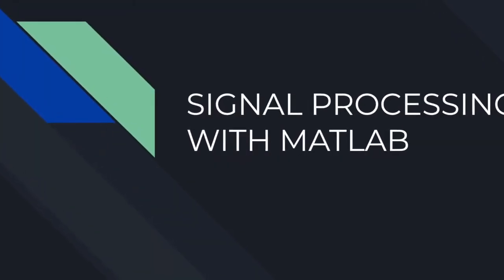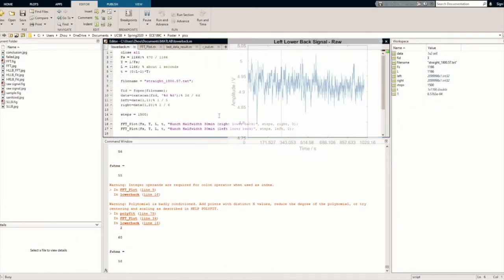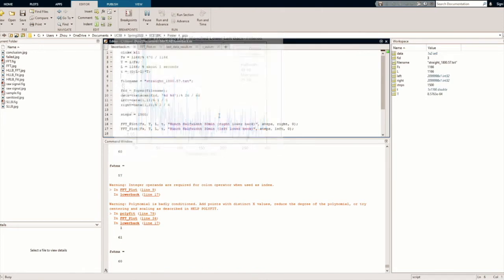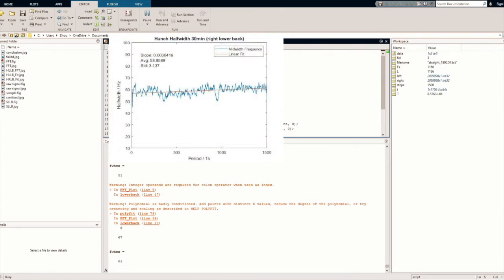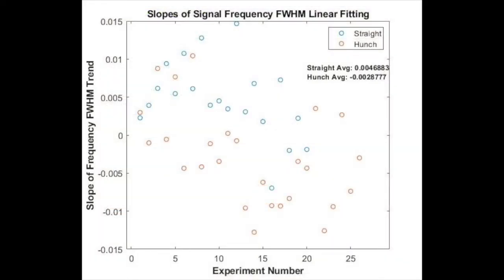The next step is about the signal processing within MATLAB. The function of this MATLAB script is to extract data from the original text file. The fast Fourier transform results will be generated, and the full width at half maximum values will be calculated to show the shifting trend of frequency. After plotting all the slopes in one diagram, you can obviously see the fatigue level difference between two postures and make a conclusion.